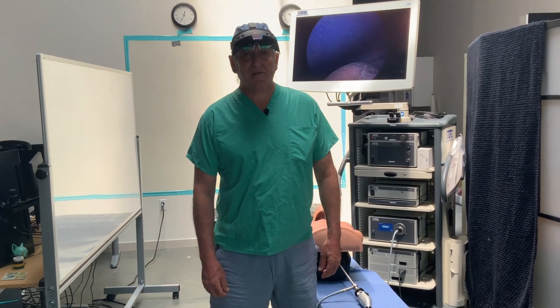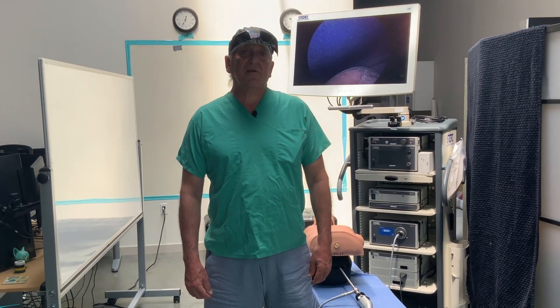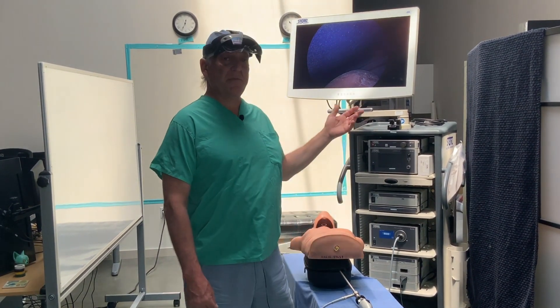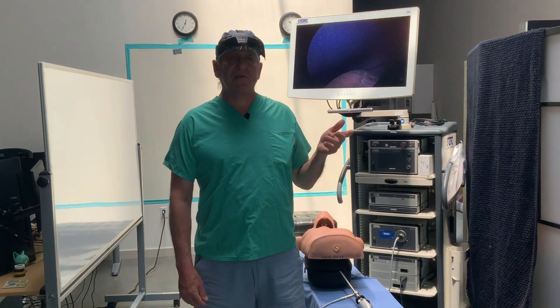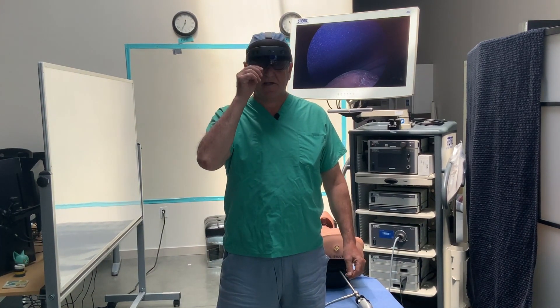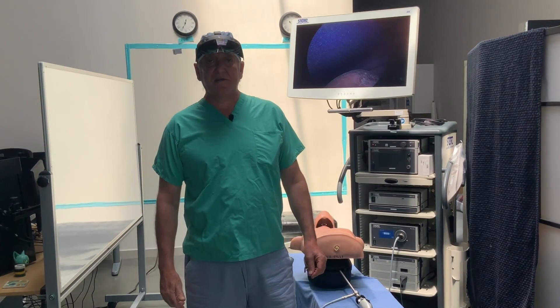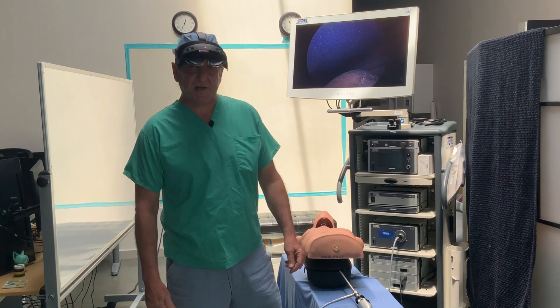Hi, I'm Dr. David Pearlstone. Today we're going to take a look at comparing a standard diagnostic laparoscopy using a standard laparoscopy tower versus doing it with the Microsoft HoloLens. So first we're going to go and take a look at a standard diagnostic laparoscopy using our simulation set here.